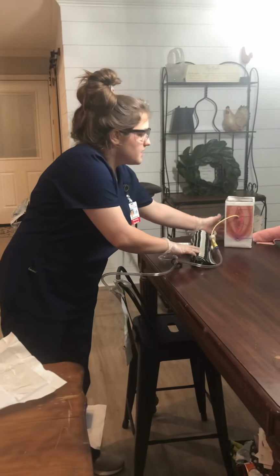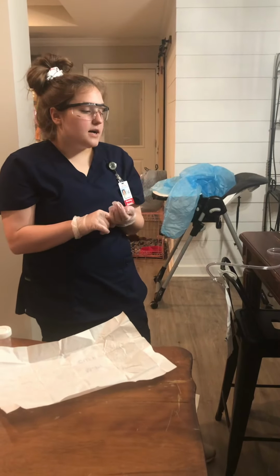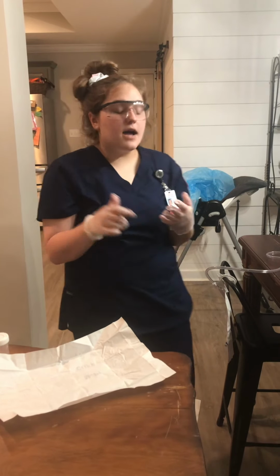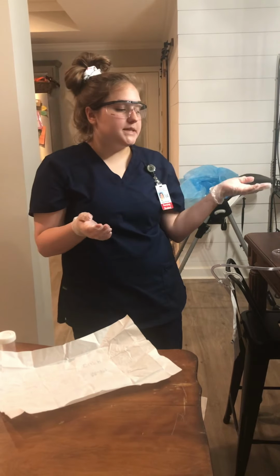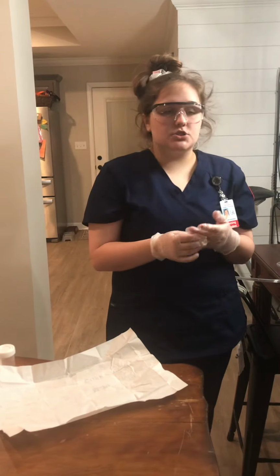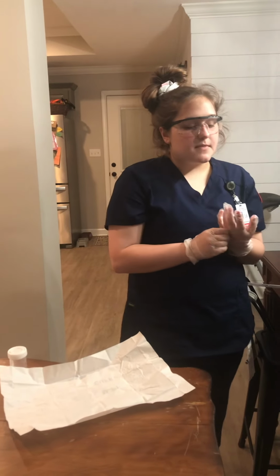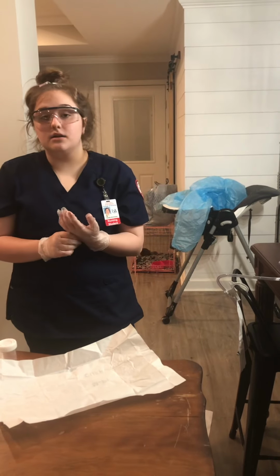So that concludes the insertion. I would document. I'm gonna document the catheter size, the amount of urine, the type, the odor, color, how the patient handled the procedure, the specimen collection, and then I would teach them catheter care. So you're gonna use soap and water, and then you're gonna wanna remove the catheter as soon as medically indicated.